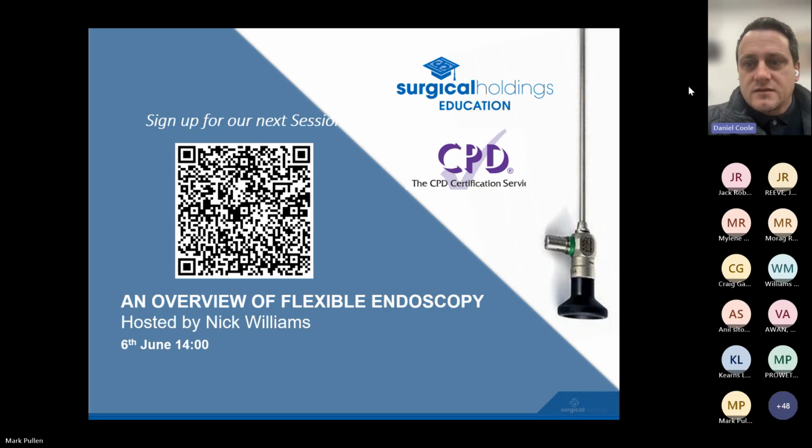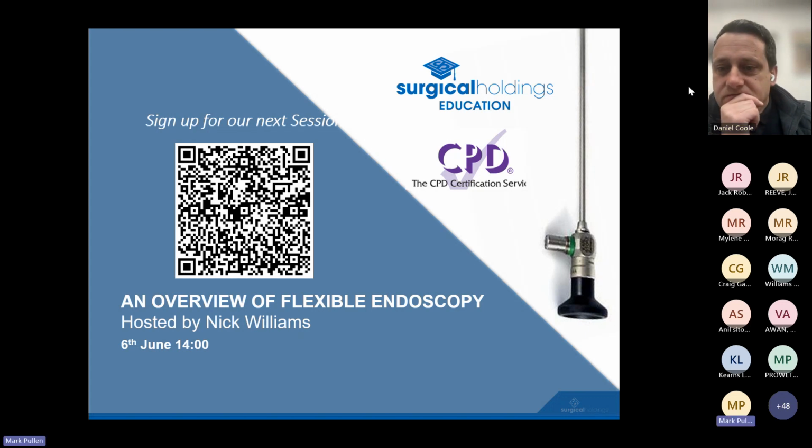Yep, good. Another question is just around the cost effectiveness of repairing light cables. Now that's not something that we tend to do. Probably not particularly cost effective, I would say, from my perception. But Mark, that's not something generally that you've seen too much repairing of, the actual light cables themselves? No, I don't think so. We very rarely get asked to repair anymore. Like Dan said, there's not much incentive to have them repaired when a new one is not much more. So generally people just replace them.